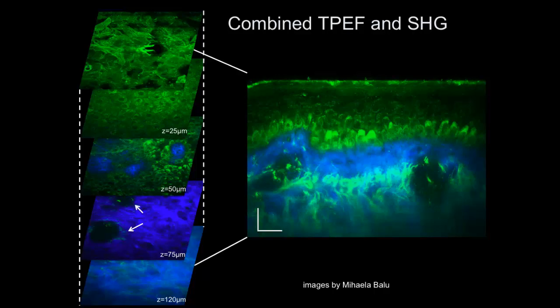Okay, below you see collagen. That's second harmonic generation of collagen. You see beautiful structure in there. You see also even deeper some fluorescence from elastin. So you see collagen, elastin, and NADH allows for a full view of the structure of the tissue. Okay, without any labels. I don't put anything on this patient. The patient just puts his arm like this, and we can go through, up to this depth. So a beautiful contrast.